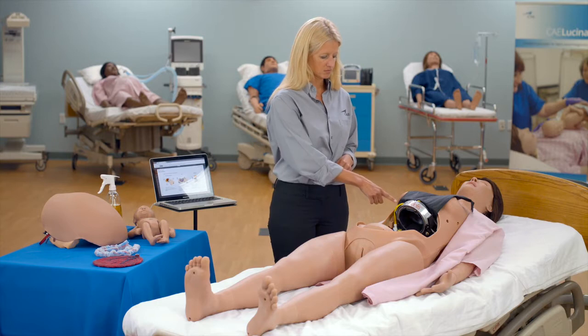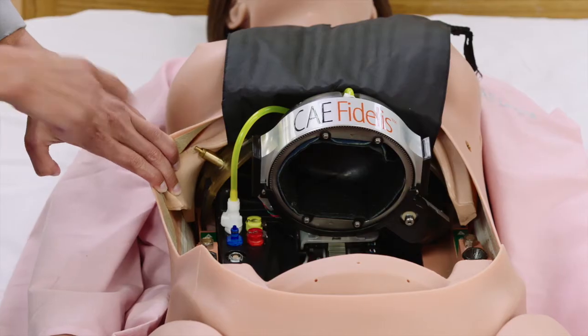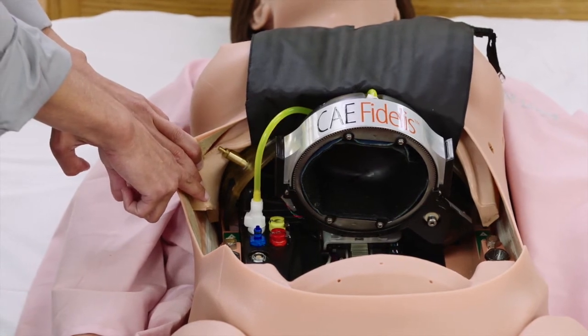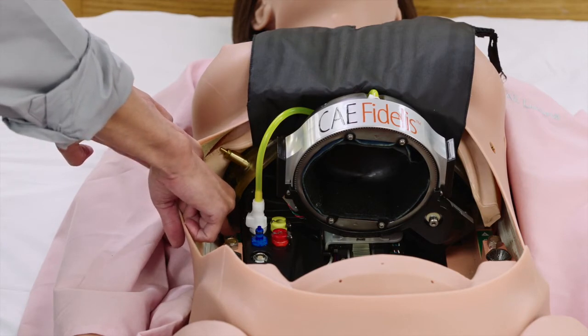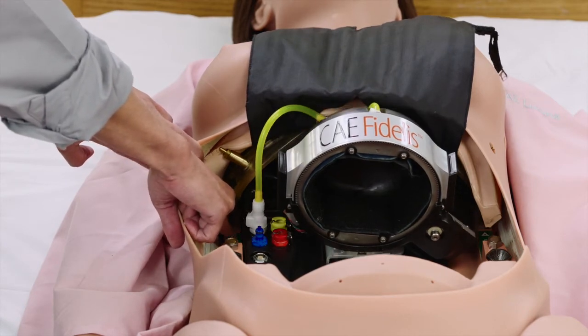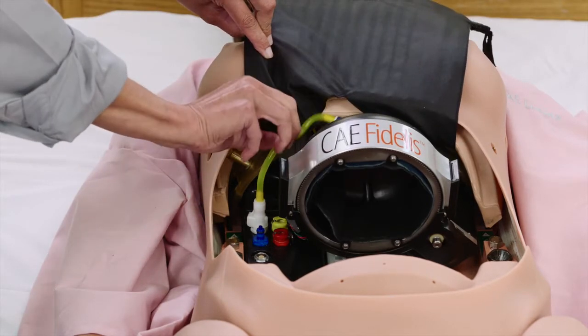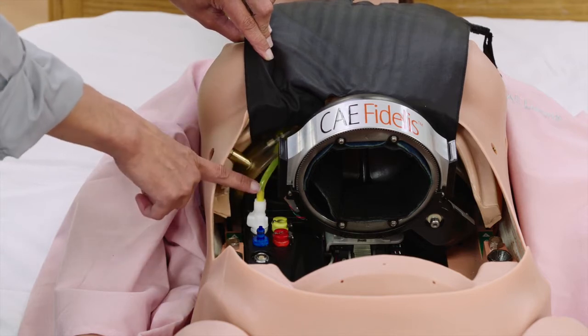Prior to loading the fetus, ensure the descent mechanism is properly returned to the home position. Manually return the rotation ring to the home position by pressing the upward arrow button on the gripper button pad. Hold for three seconds after the rotation ring reaches the top of the descent mechanism and wait until the rotation ring rotates to the home position. Ensure there are no kinks in the yellow tubing on the rotation ring.